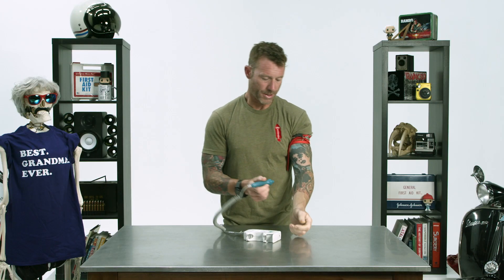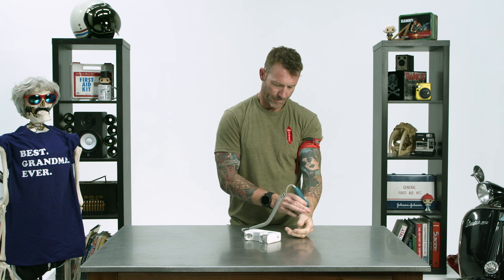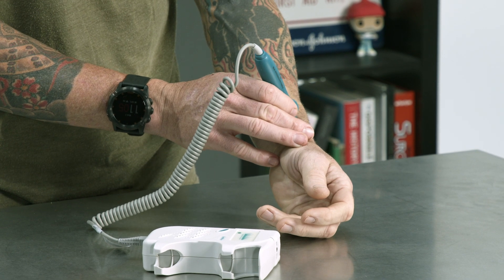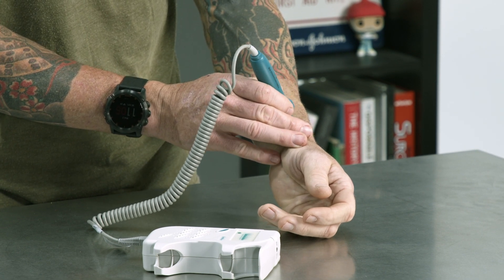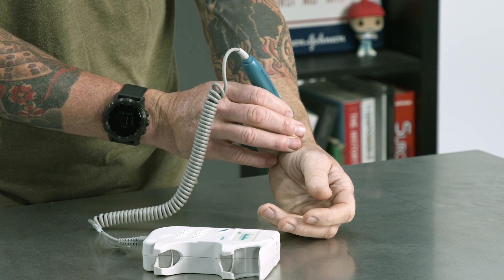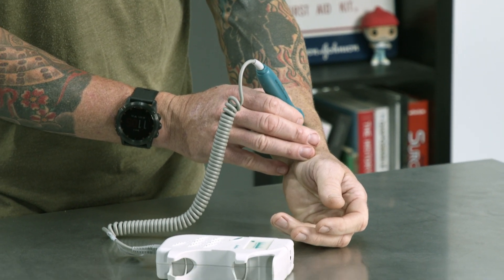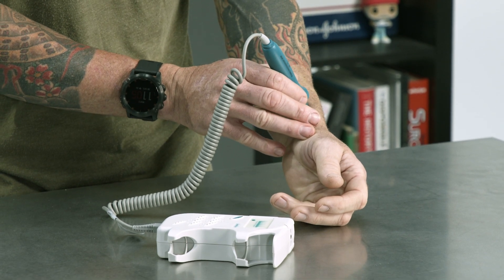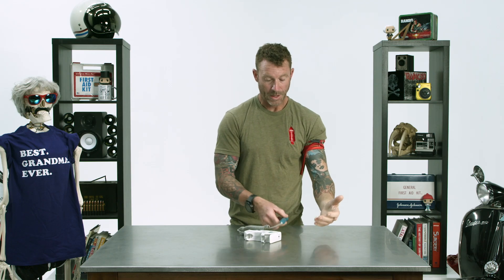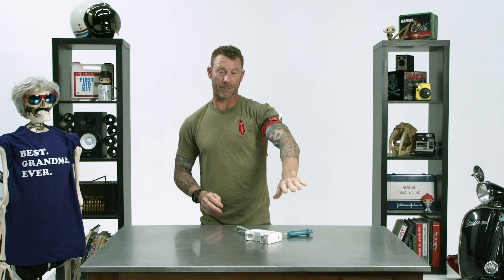Good on that side. Let's see if we can pick something up on the tourniquet side. I'm going to guess by the paleness of my entire arm and the discomfort that it's working just fine. Nothing. So I'm happy with the results — I certainly don't feel any pulse, and we don't have anything coming up on the Doppler. That tells me this has cut off arterial blood flow.